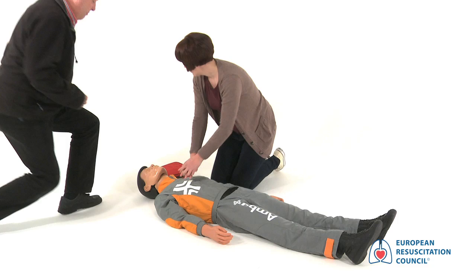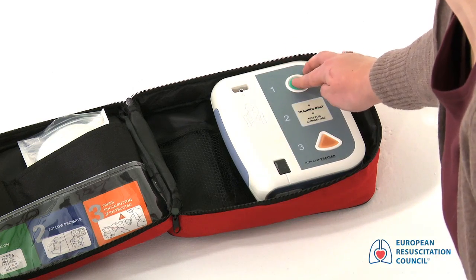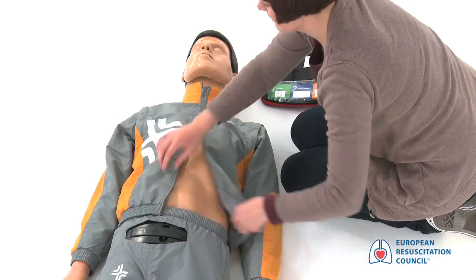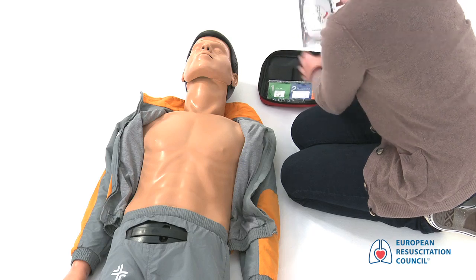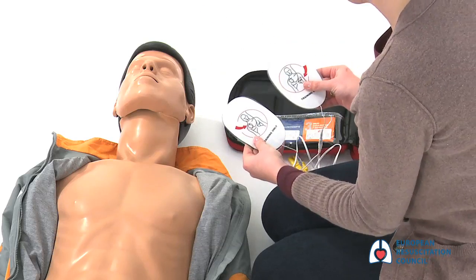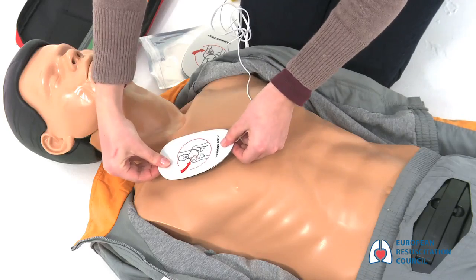Here's an AED. Apply pads to patient's bare chest. Plug in pads connector next to flashing light.